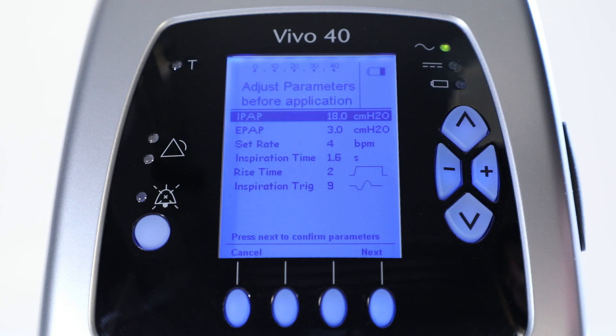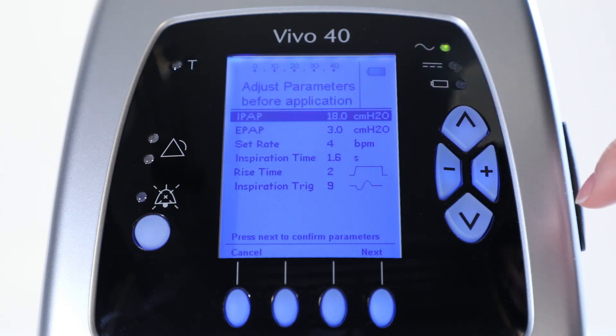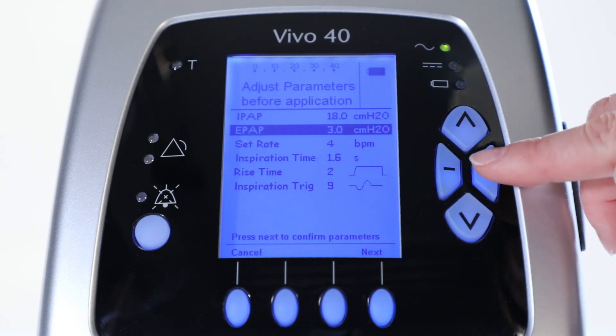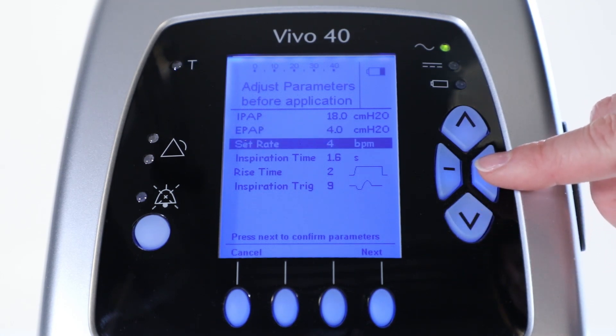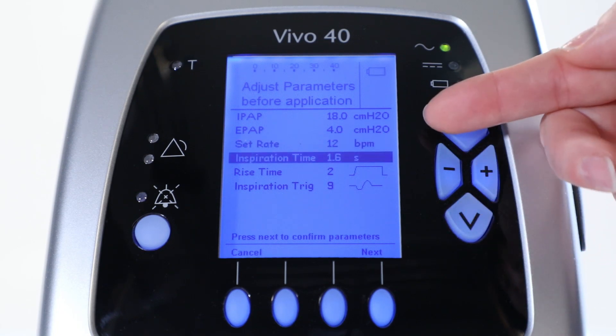First, you select a certain pressure you want to deliver to the patient. In this case we have chosen 18 centimeters of water. Next, you select the EPAP and adjust it to 4 centimeters of water. Furthermore, you select the set rate and adjust it to 12 breaths per minute. You set inspiration time at 1.6 seconds.